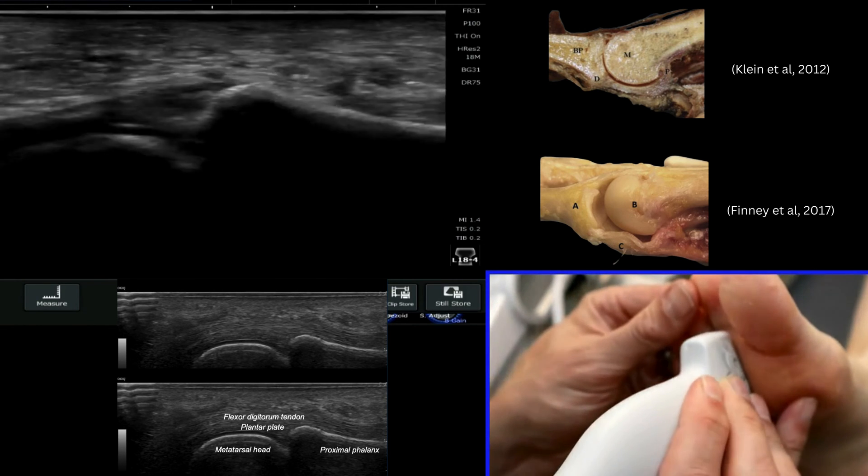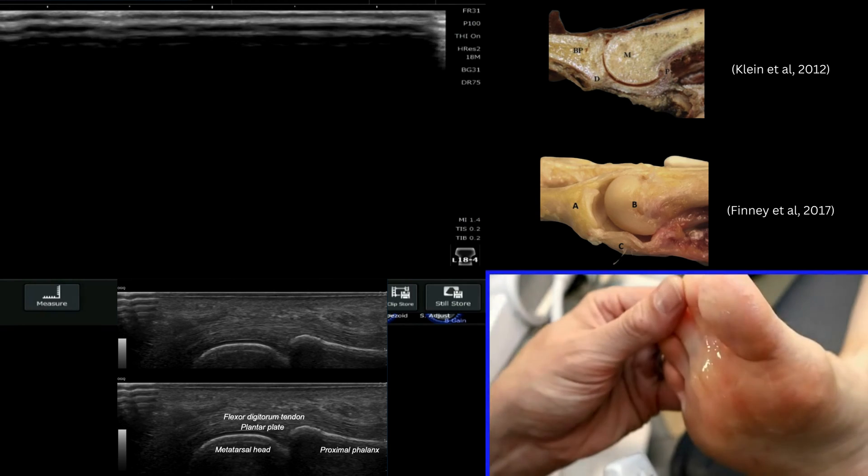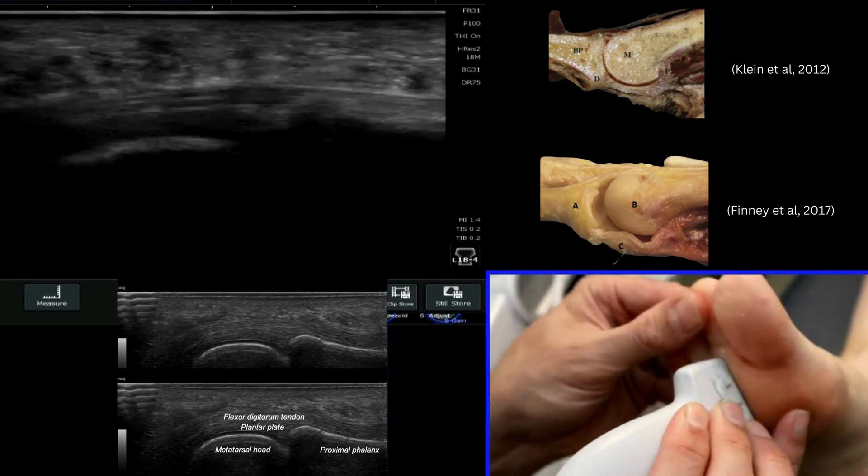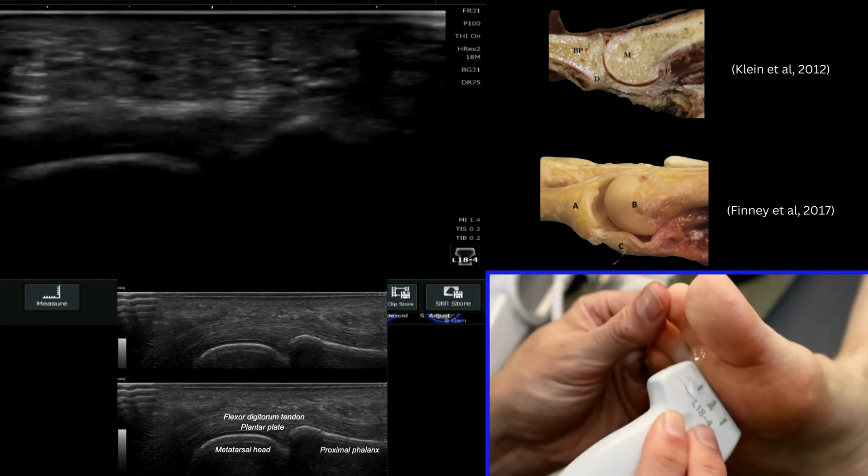If we pull the foot up and ask the patient to tension the foot, it helps because it tightens these structures underneath. You can also control the toe when you're looking at it.